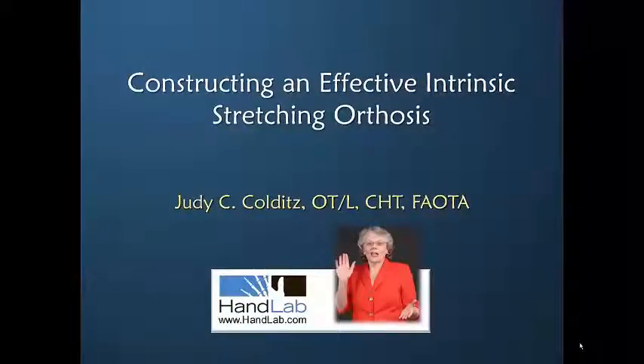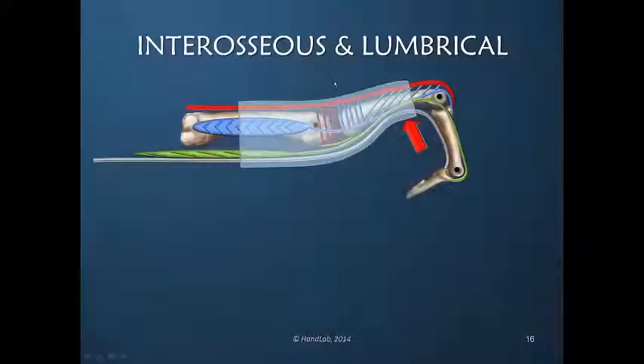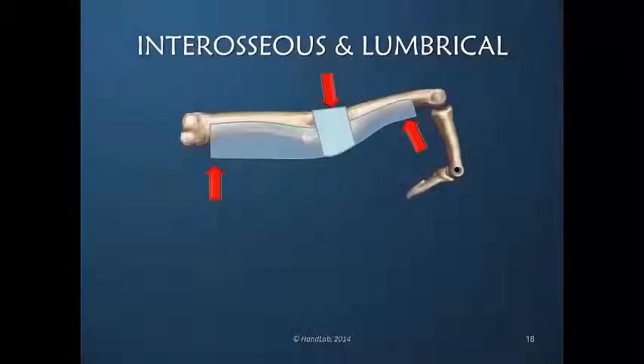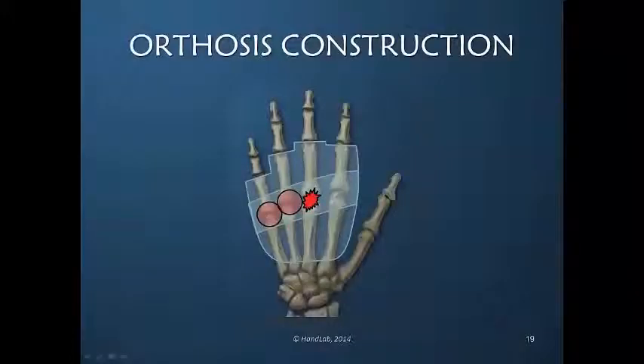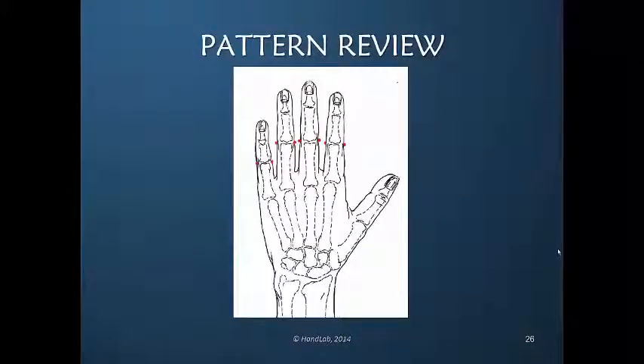Welcome to Constructing an Effective Intrinsic Stretching Orthosis. The range of hyperextension increases the length demanded of these muscles and does not provide precise stability. The highest of the group in the arch often receives undue pressure. Identify the exact axis of each PIP joint.